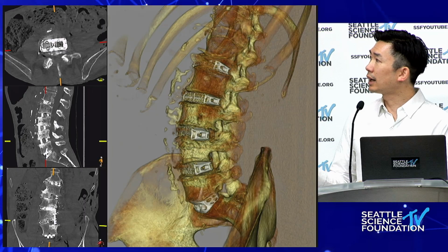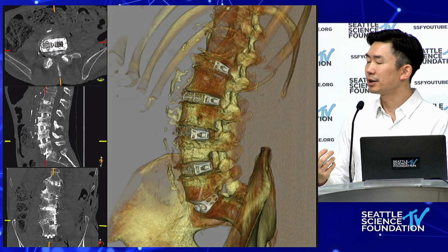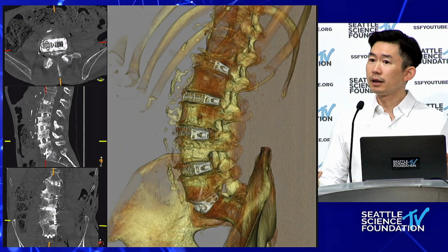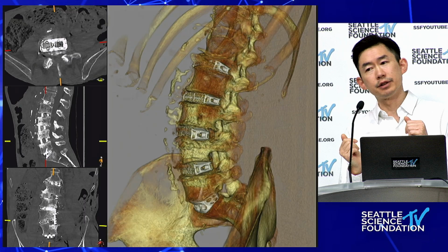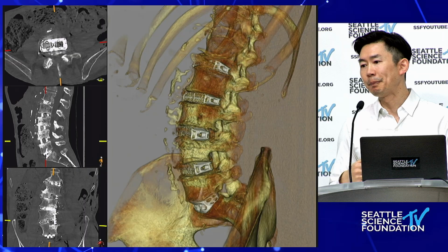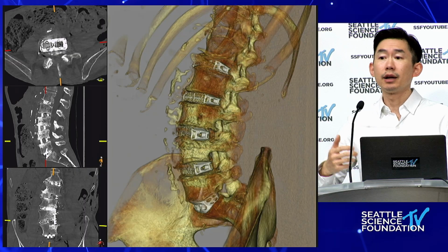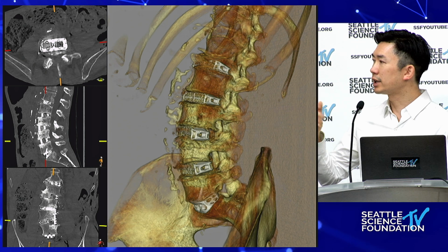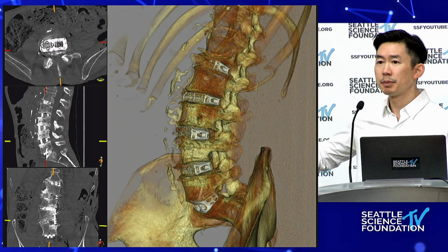Again, that said, I rely a lot on the predictive analytics of things. Many companies now will help to simulate what the spine looks like based off of either the cages you do or the osteotomies you do. And so I admittedly rely on that, right? It's not perfect, but based off of that preoperative simulation, I know that this is the maximum I'm going to get.